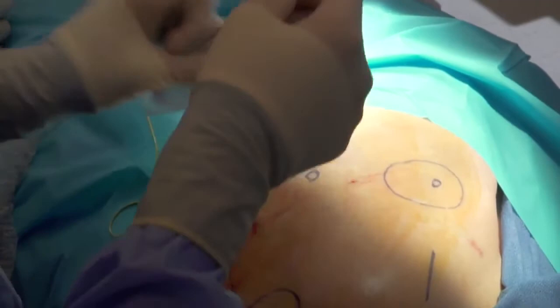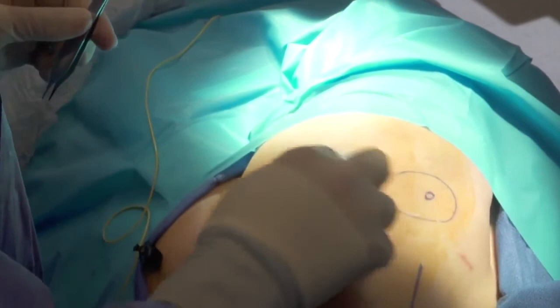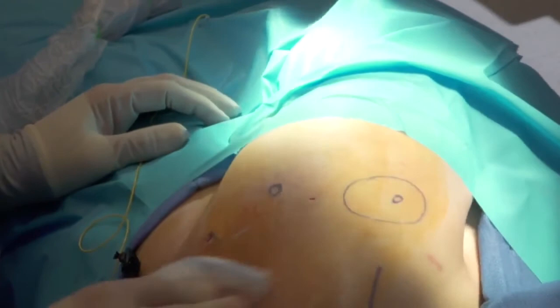Oh, good. I know I'm going to feel it. Yes, sir, once it wears off. You did great. What I'm going to do now is clean the area. I'm going to place a little Dermabond on there, and then we're good to go, bud. Not too bad, right? I'm going to be sore after that. I'm going to give you some medication, and we're going to make sure we cover your soreness afterwards, okay?